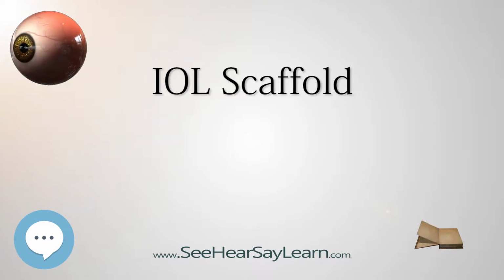This technique is called IOL scaffold and was started by Dr. Amar Agarwal from Chennai, India at Dr. Agarwal's Eye Hospital. Definition: the lens bag in which the new artificial lens is kept may be damaged due to trauma, from birth, or by surgery. During cataract surgery, when half or more of the lens is remaining and the operating surgeon notices capsule damage, the IOL scaffold technique can be used to rescue the lens and prevent further complications.